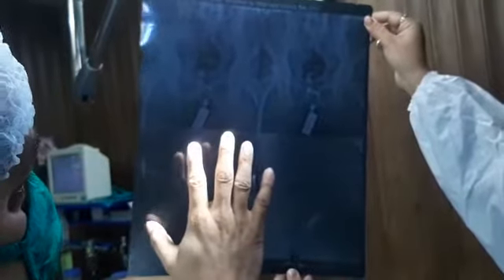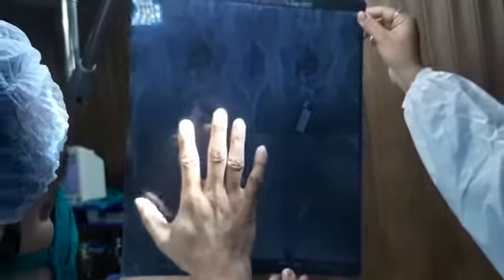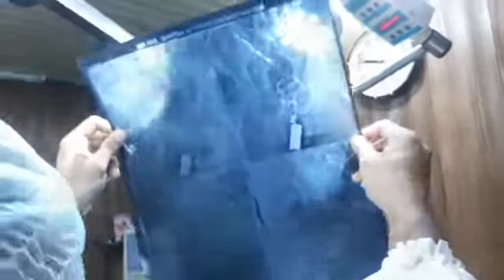So in this case, I approached with the technique of partial fistulectomy followed by Seton suture ligation. As this tract is going up to the anorectal junction, and you can clearly see in this — especially in the lateral view — you can see the tract here. It is clearly seen. It is going posterior to the coccyx also.